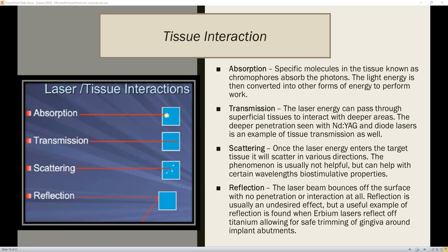You haven't had that yet. When is the abutment placed? How is the excess tissue removed from the abutment in the traditional manner? Well, the lasers can replace the blade.